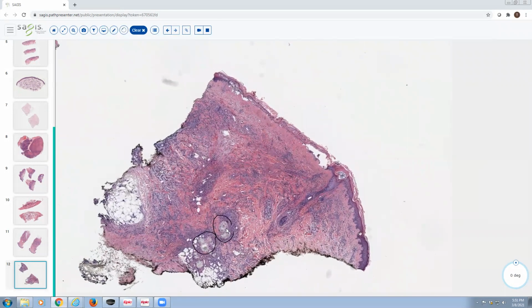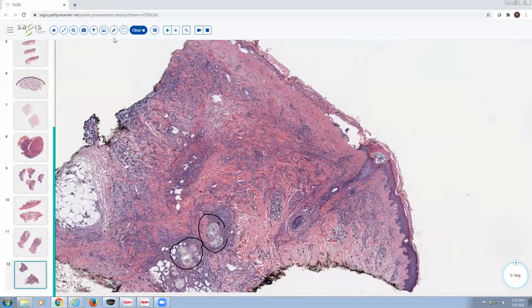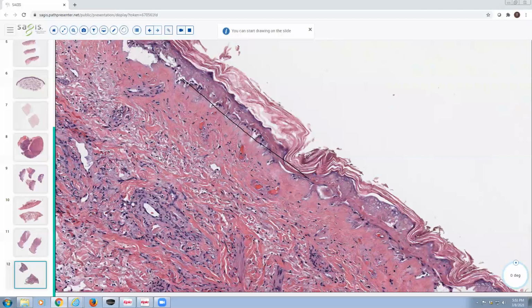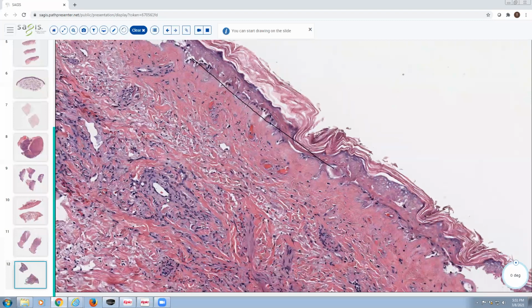So I'm definitely going to want to go look at those and key in on those. But just looking at the overlying epidermis, you have epidermal necrosis and detachment. That is a consequence of ischemia. So some of the vessels in oxalosis become thrombosed due to the inflammation and the crystal deposition.